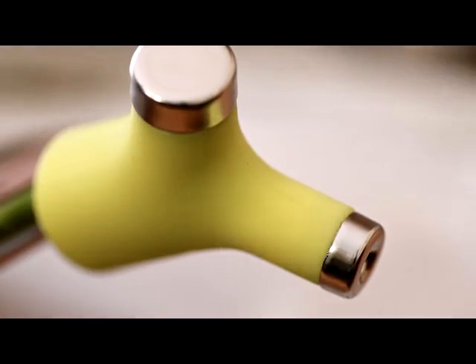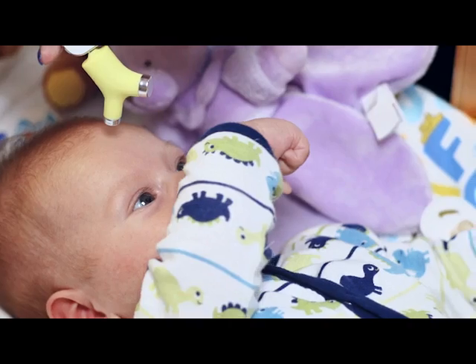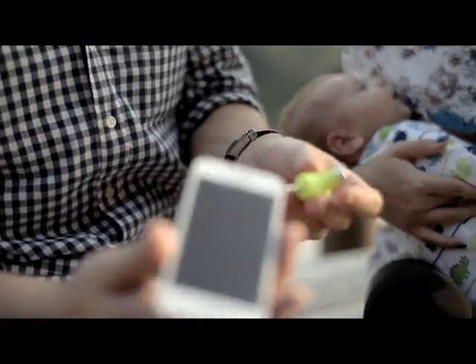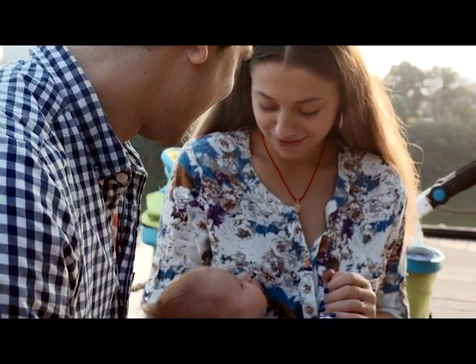At Wishbone, we've created the world's smallest and smartest non-contact thermometer, perfect for taking your child's temperature in under two seconds. Comparing to traditional thermometers, Wishbone is much smaller, works faster, and is less prone to user error — and it doesn't contain mercury.